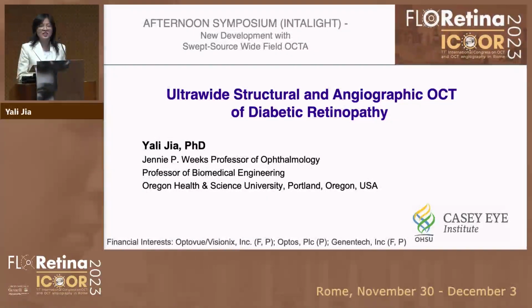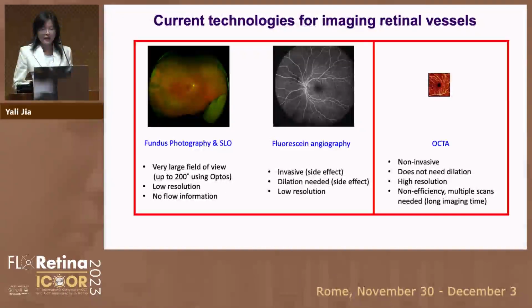I slightly changed my title because my previous inherited disease study was delayed due to the study protocol. I have to switch to a different type of disease we scanned. I'm going to share my experience, just two months of experience, showing ultra-wide structural and angiography OCT of DR.